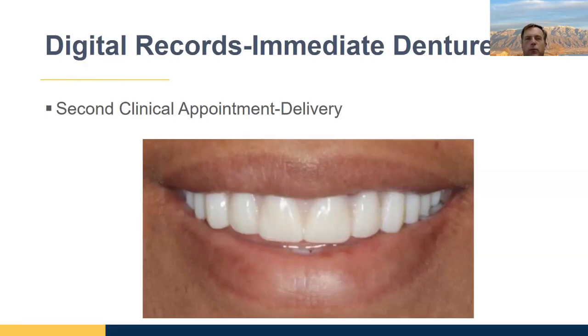The question is, would you recommend a printed immediate denture and then a milled second denture, since it's more accurate, 6 weeks to 4 months later? What I would say is that the difference between the two is not relevant for dentures because of the amount of deflection of the tissue. You're talking about the difference between a mill, a good mill's maybe accurate to 10 microns, and a printer at 50 to 100 microns. So either is not going to really affect the denture.